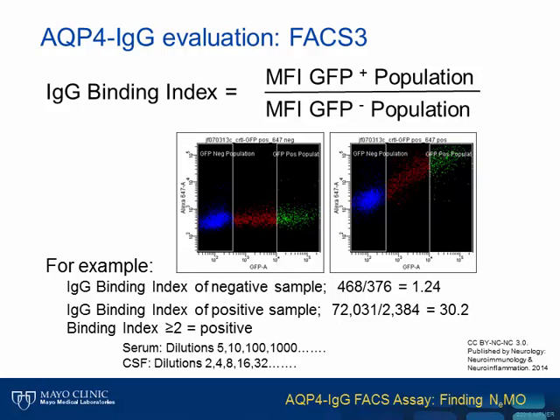Most patients' titers generally fall around the 5, 10, 100, or 1,000 mark. Generally, titers do not go beyond 100,000. And the same approach is taken for spinal fluid. Thus, with the FACS assay now, we will be able to offer you an end dilution or an end titer for both these assays.